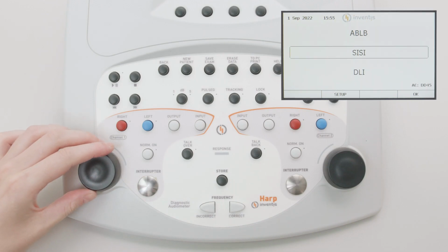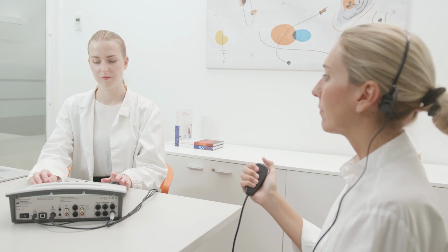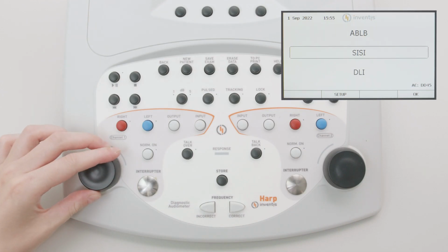SISI, Short Increment Sensitivity Index, is used to assess the ability of the ear to identify brief variations of intensity in a continuous pure tone. The patient should press the patient button each time an increment is perceived. DLI, Difference Limen for Intensity, is used to determine the amplitude of the smallest variation in intensity of a pure tone that can be perceived by a patient.